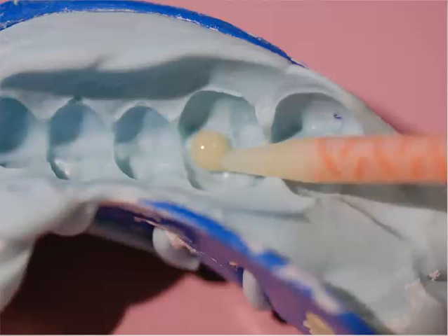And speaking of making our provisionals, which I alluded to before the patient comes in, before you start preparation, we always take pre-op impressions, whether they're quarter arch or half arch anteriors. These will allow you to convey information to the technician, such as morphology and occlusal scheme. We also do an opposing model. I don't even use alginate anymore other than just for study models. When it comes to crown and bridge, and especially CAD-CAM cases, we want to have really dense, really firm, accurate models. We always use a VPS type of material.